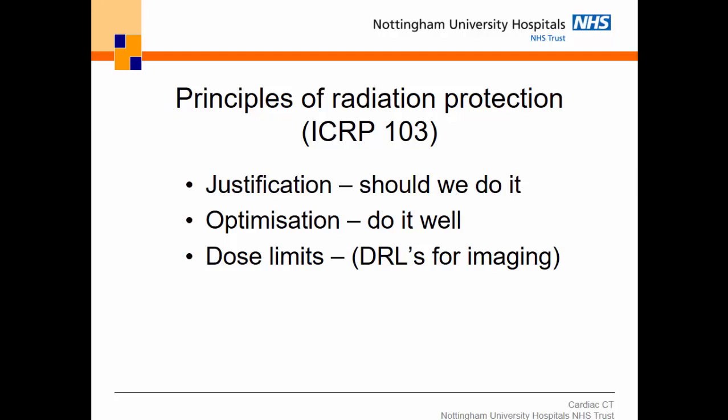Okay. Once you've decided that something is justified and is going to go ahead, optimization is about doing it well. So now we're going to do this particular scan. We should do it to the best of our ability and using the lowest radiation dose required to gather the information we need to make a diagnosis. Okay, and then the final one is dose limits. It doesn't technically apply to medical uses, but we tend to use DRLs, or diagnostic reference levels, certainly in the EU anyway, and that concept applies across the world.